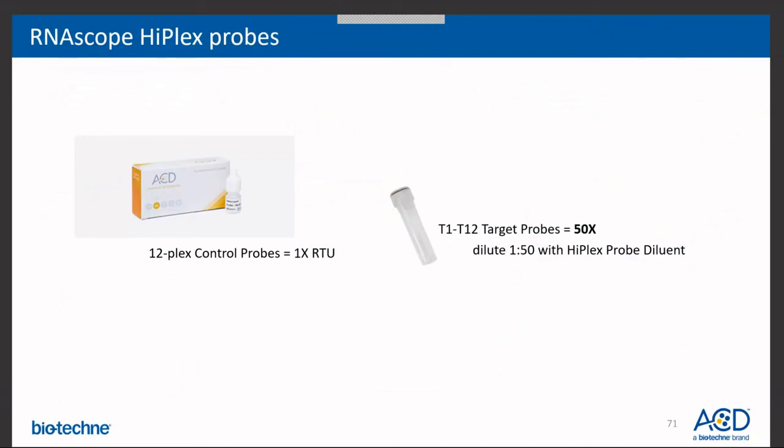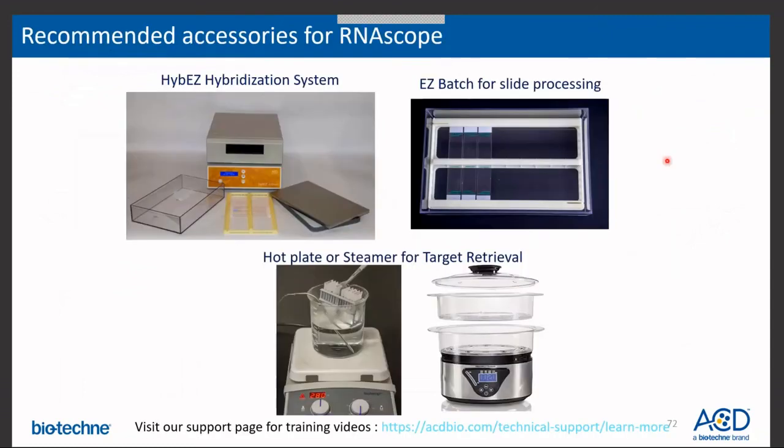the slide. Again, most of the kit reagents come in these little dropper bottles. It makes the kit so easy to use. The one thing you'll really need the pipette for is to do this dilution factor.